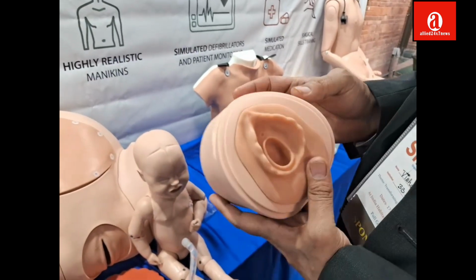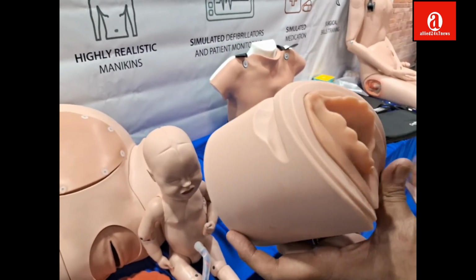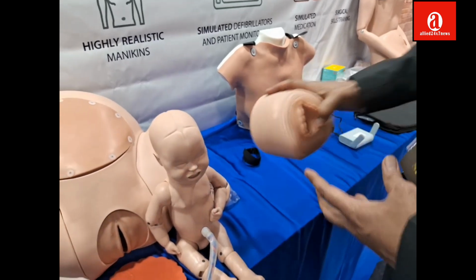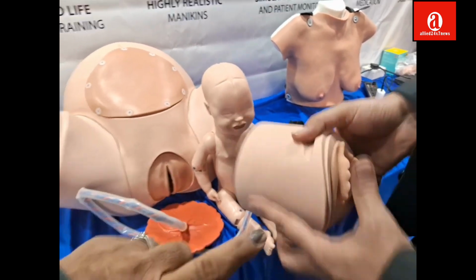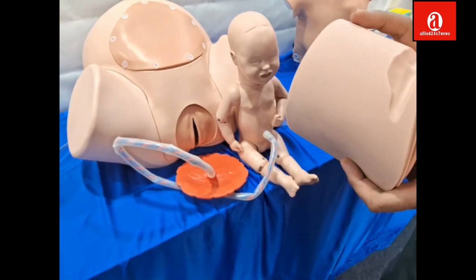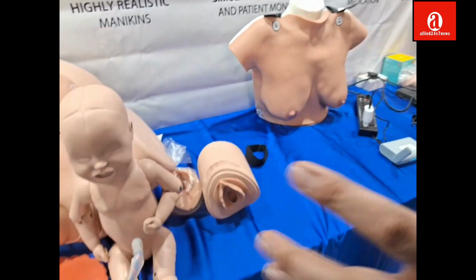So that's how it's episiotomy. It's mediolateral or medial. They cut and then they suture it again after the birth. So all that procedure, the same model? Yes, this simulator would be the same. This could go inside this fixture. Right, and then they can do this, one part at a time.